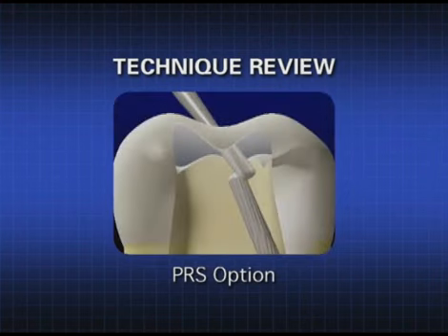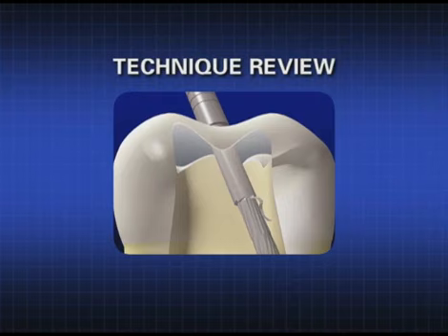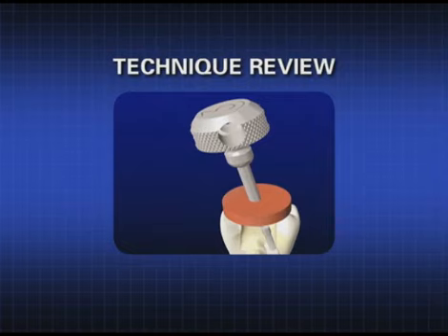If ultrasonics alone is unsuccessful, dome the head of the post with a transmetal burr. Select an appropriately sized trephine and machine down the post with emphasis on PEC drilling to reduce heat and increase efficiency. Once the post has been precisely machined down, a correspondingly sized tubular tap with a protective bumper is rotated counterclockwise to form threads and strongly engage the post.